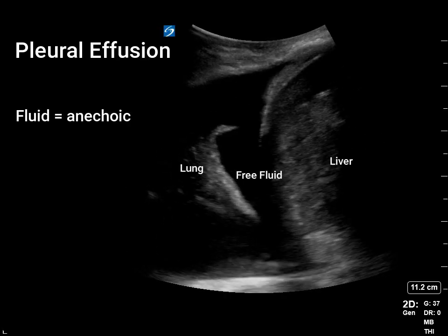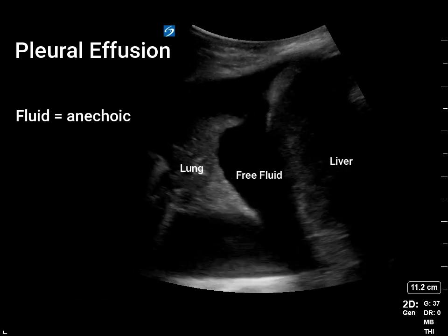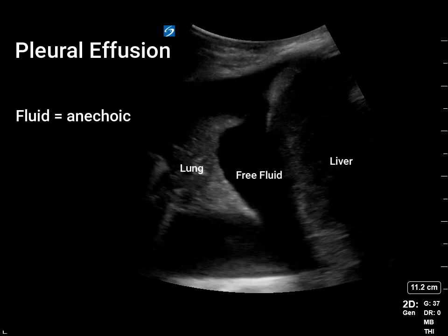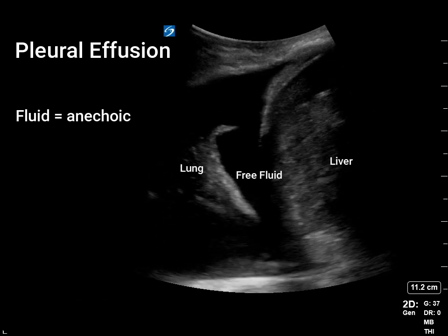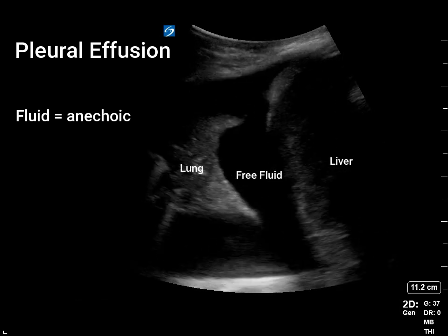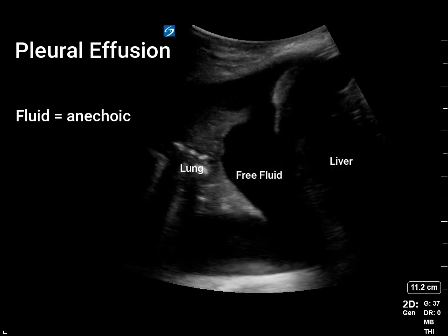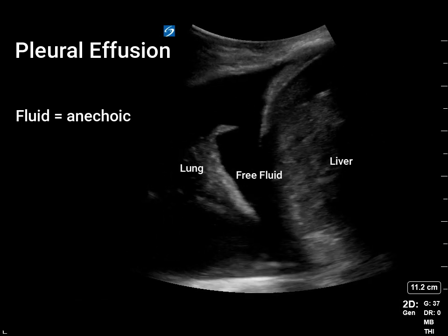In this video of the right lung, we can see anechoic free fluid in the pleural cavity. The lung appears to float in it. This patient's effusion was due to heart failure.